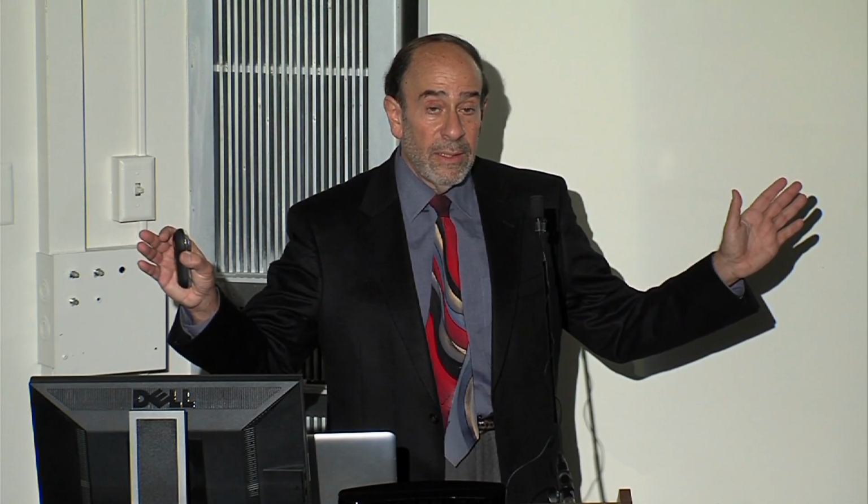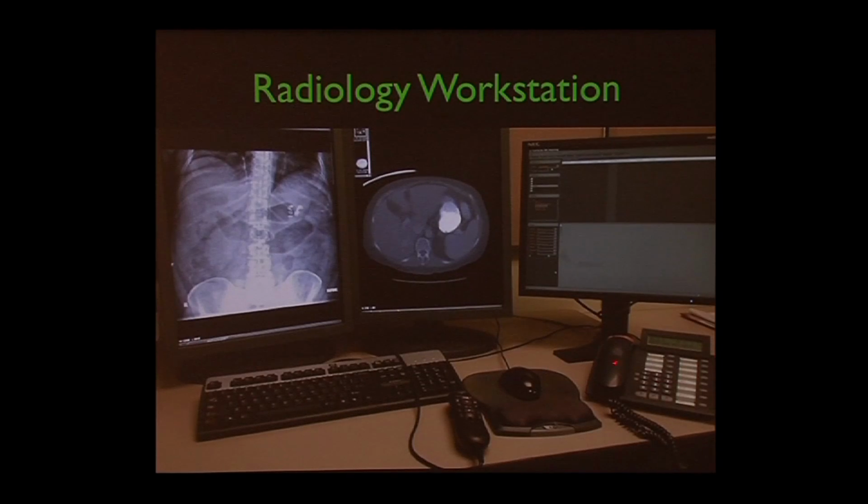Now it's pretty accurate. And then when I click the button to sign it off, it goes out to the clinicians right then. I mean, it's instantaneous. So often before the patient even leaves our area, the clinician has a report. Or I pick up that other device, which is still extremely important. I use that 20, 25 times a day. And I talk to the emergency department about what they know, so I get this little information on the patient. And they expand the information for me. I tell them what our findings are, and we sort of talk about what they might mean in that patient.